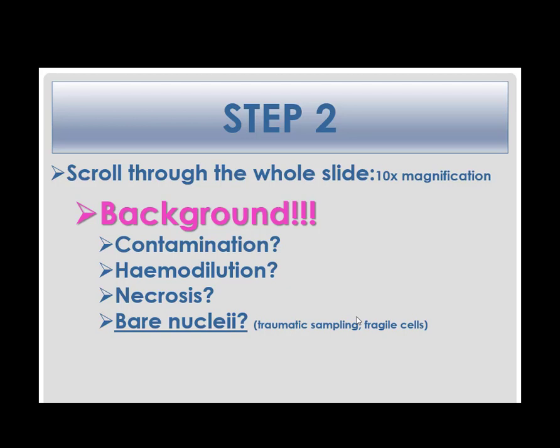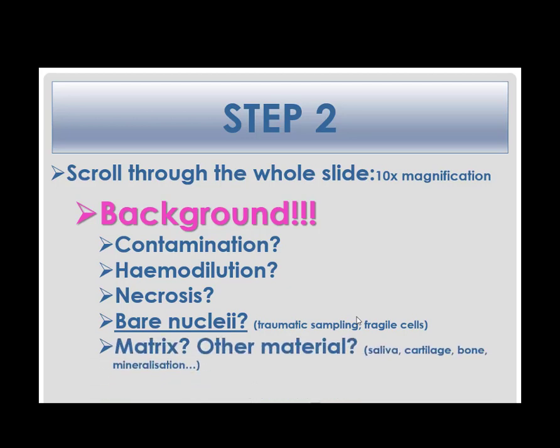Returning to the background. Is there a presence of a non-cellular matrix on the slide? It is important for you to identify the origin of the cells.